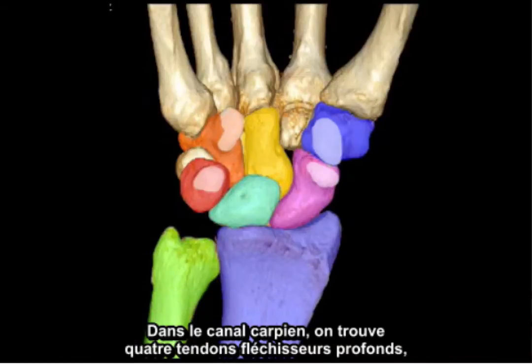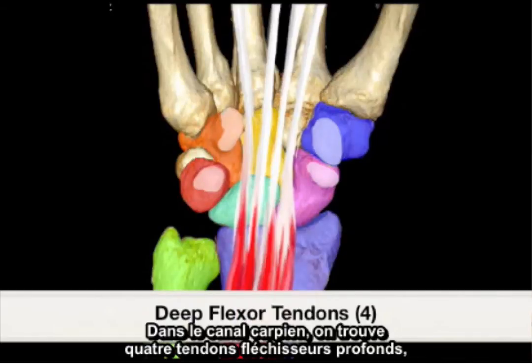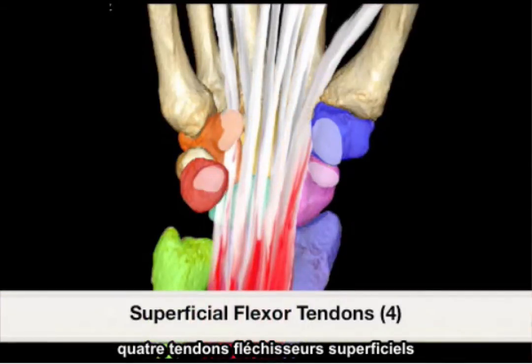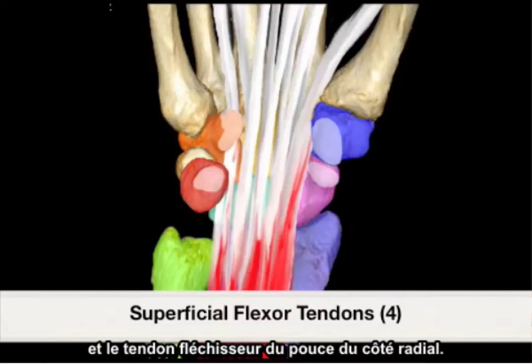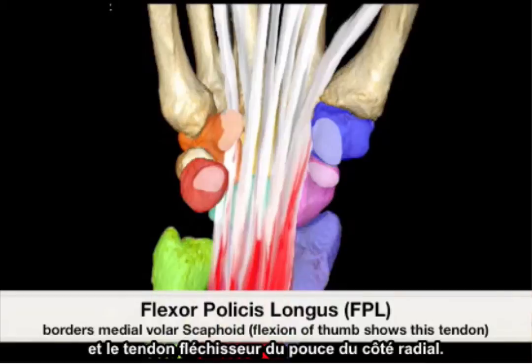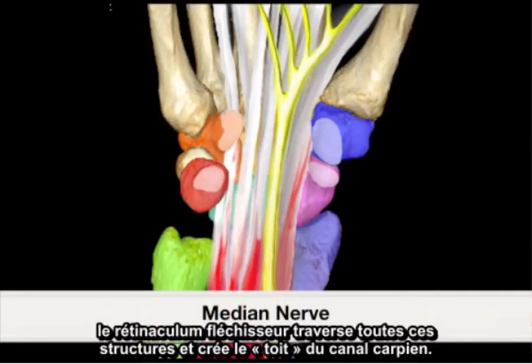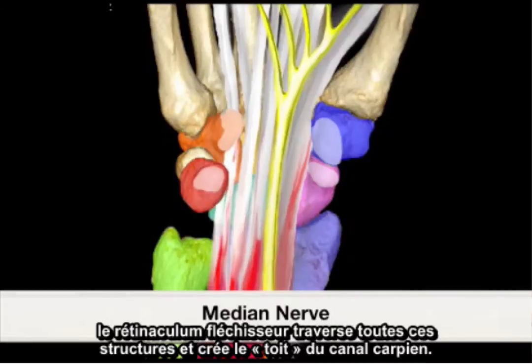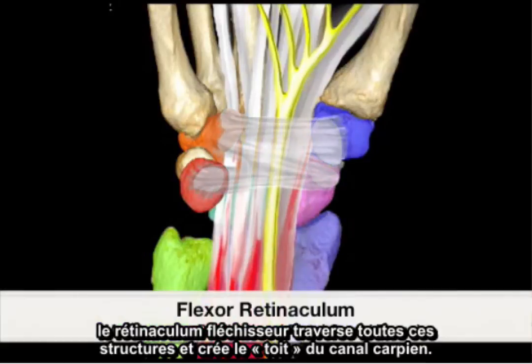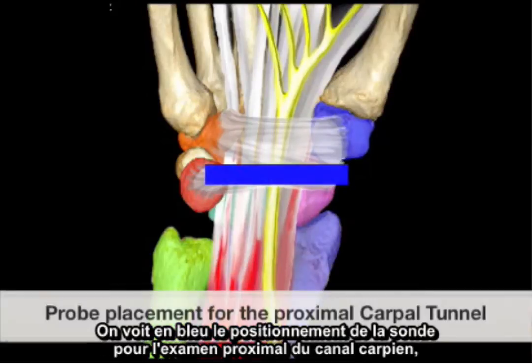Contained within the carpal tunnel are four deep flexor profundus tendons, four superficial flexor tendons, as well as the flexor pollicis longus tendon on the radial aspect, and the median nerve here in yellow. Crossing over all of these structures creating the roof of the carpal tunnel is the flexor retinaculum. Probe placement for the proximal carpal tunnel examination is in blue.